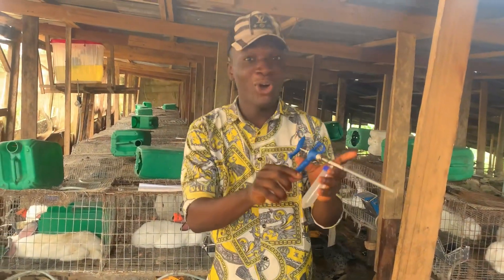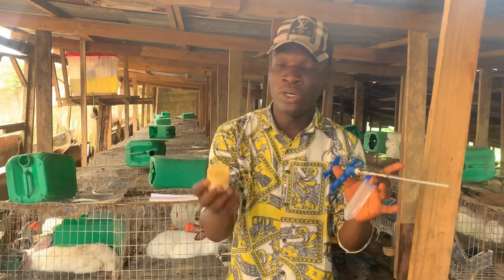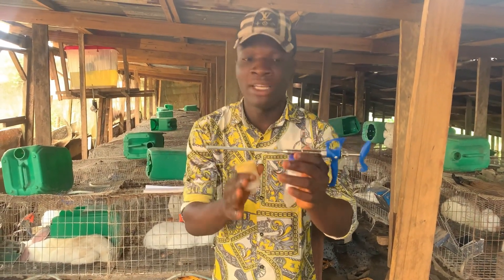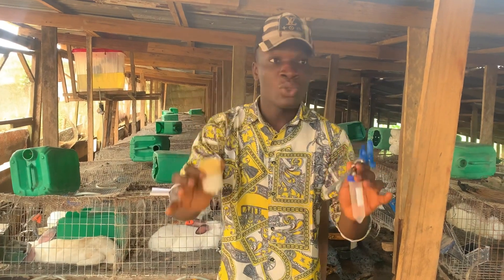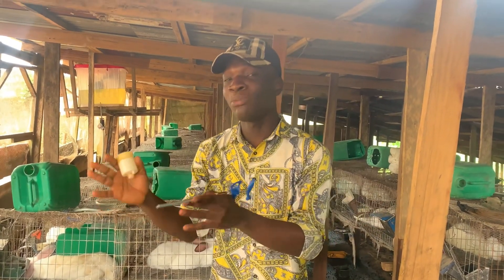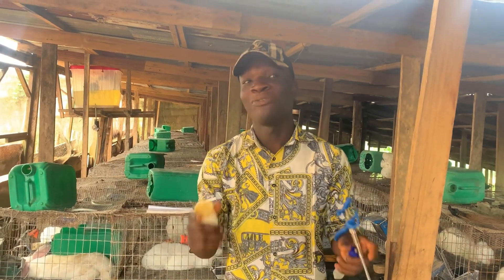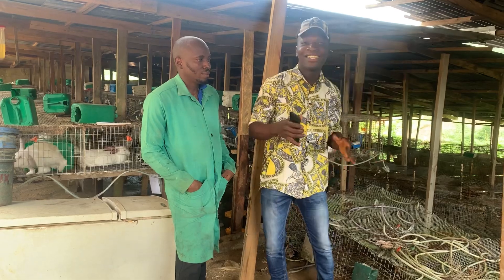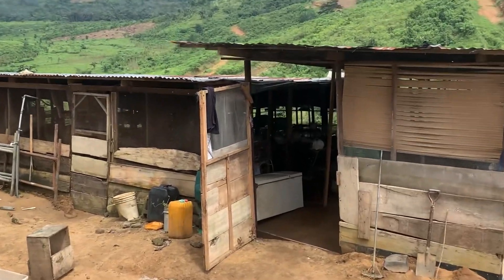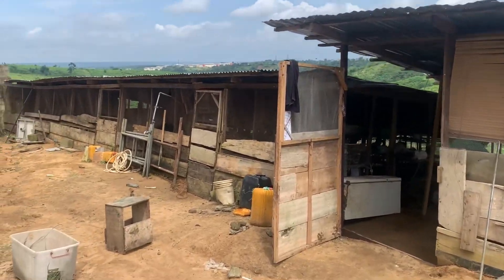This is an artificial insemination gun (AI gun) and this is the artificial vulva. In this video, we are going to be teaching you how to use this artificial insemination gun and artificial vulva to make your female rabbits get pregnant. You can use one male to impregnate up to five females in just one ejaculation. We are at one of the biggest rabbit farms here in Calabar, and the expert is going to teach us today how to use the artificial insemination machine.